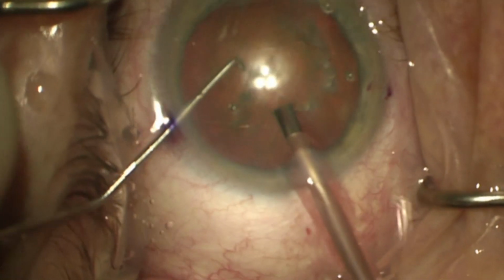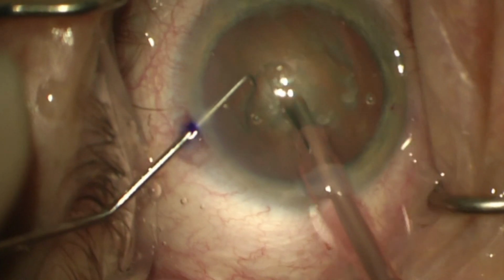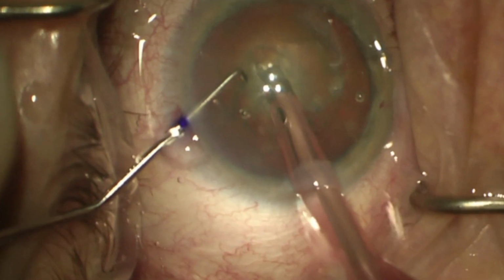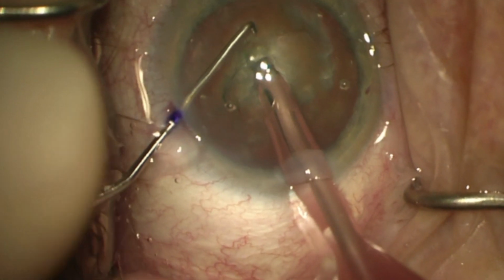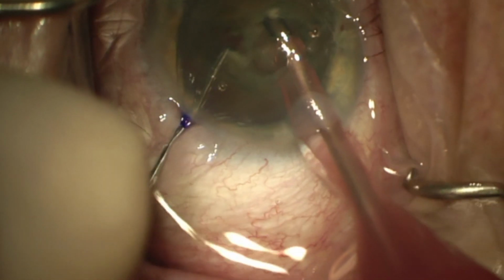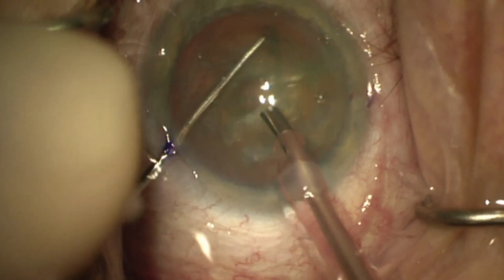For vertical chopping, you need a sharp chopper with a sharp tip, and especially a long one. This is a Seibel safety chopper, which is a nice one. I like to make a little bit of a groove, impale vertically as much as I can in that groove, so have a deep purchase on the lens, and then you bring the chopper just in front and you press down, and then you get a first separation.